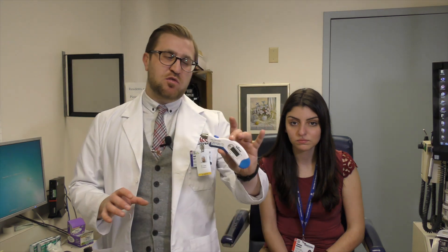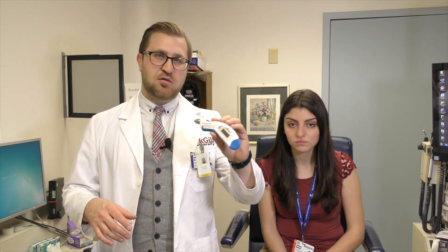This machine is one of the most common ones in the emergency department. There are many different variations of the tonopen, but this is one of the most common ones you see around the country. Most emergency clinics and family doctor clinics will have a tonopen accessible, so it's good to get familiar with it and know how to use it.